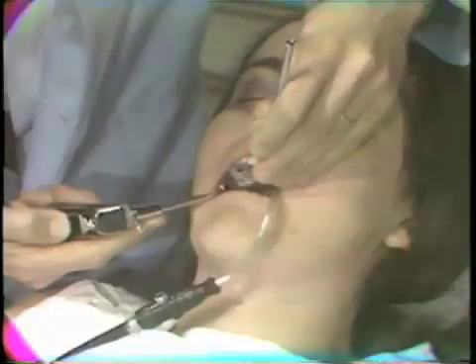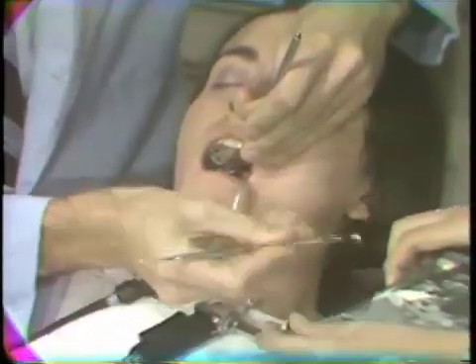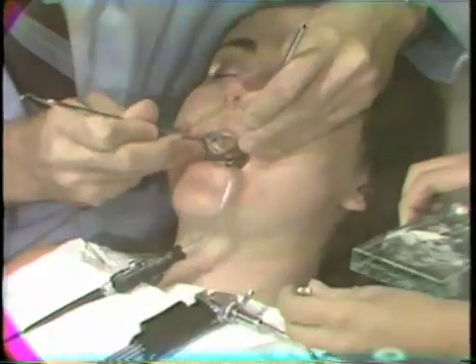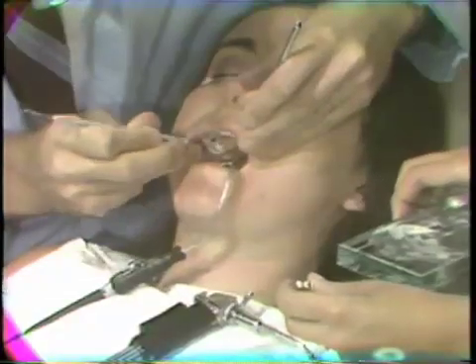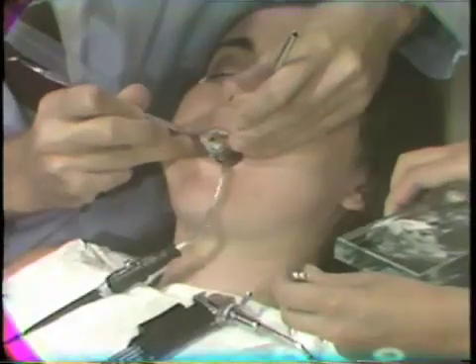A little air to be sure that there is no excess remaining varnish. A small amount of cement is now going to be placed into the prepared cavity, particularly in the proximal and cervical areas. This provides assurance that any brief seepage of tissue fluid that may take place during this process will be expressed away with that cement.